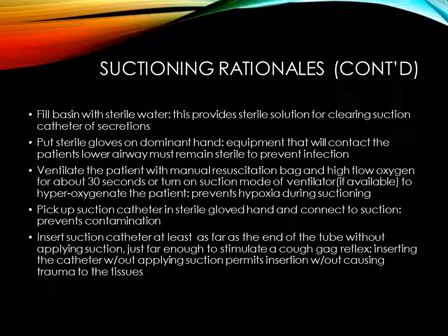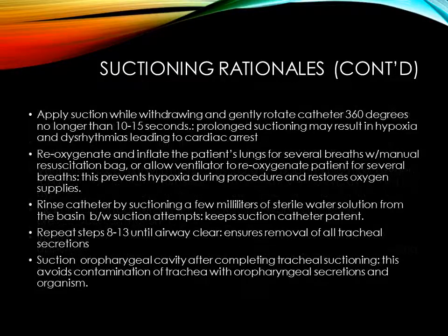Insert the suction catheter at least as far as the end of the tubing without applying suction, just far enough to stimulate a cough-gag reflex. Inserting the catheter without applying suction permits insertion without causing trauma to the tissues. Apply suction while withdrawing and gently rotating the catheter 360 degrees for no longer than 10 to 15 seconds. Prolonged suctioning may result in hypoxia and dysrhythmias, leading to cardiac arrest.